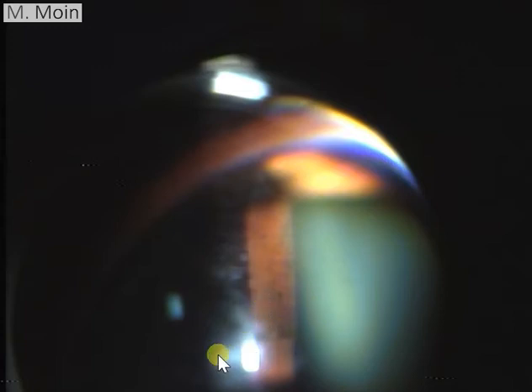Next we go down and ask the patient to look down, and while looking down you can see the inferior meniscus of the oil. So this patient seems to have about an 80% fill of oil. Let me get a good look at this and I'll show you. This is the area of the silicone oil which we're seeing, and this is the area of buckle which we're seeing over here. Keep looking at this area of silicone oil inferior meniscus. If I move, this area of the silicone oil is more prominent over here, so you can easily see it. This is the area of silicone oil. This is the end of the buckle which you're seeing. And these are cryo marks on the buckle.